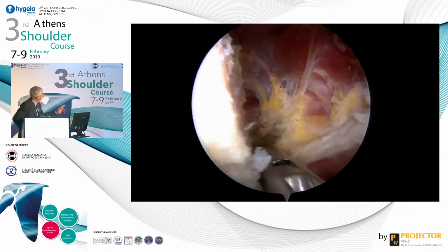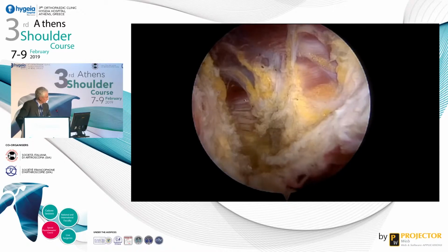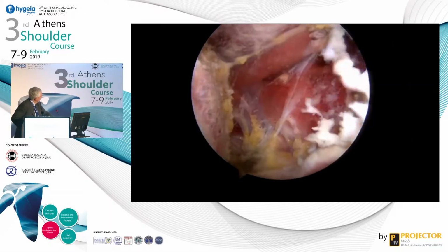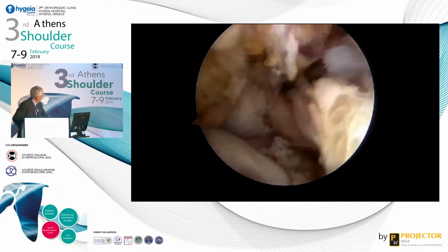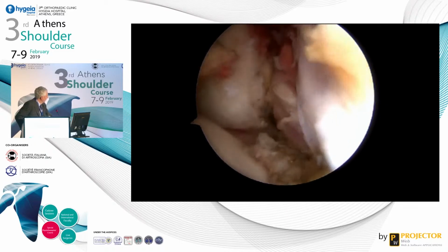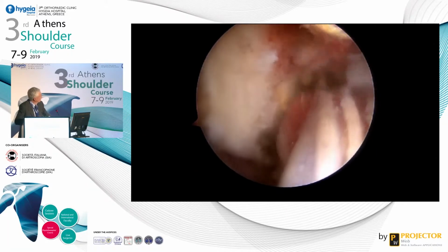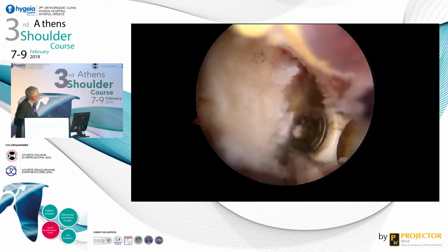It's a failure of Bankart repair, and you can remove everything this way. You see the glenoid surface is very flat and it's perfect. You can check it very well. You prepare the subscapularis split as in the previous technique.